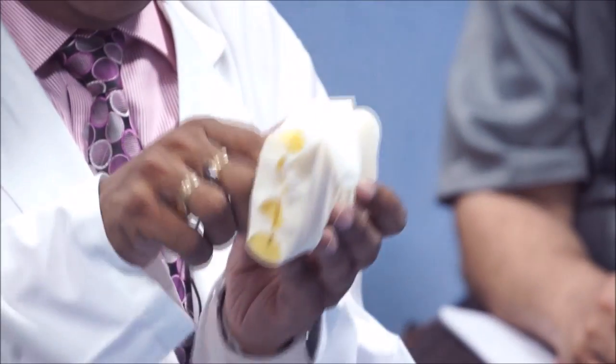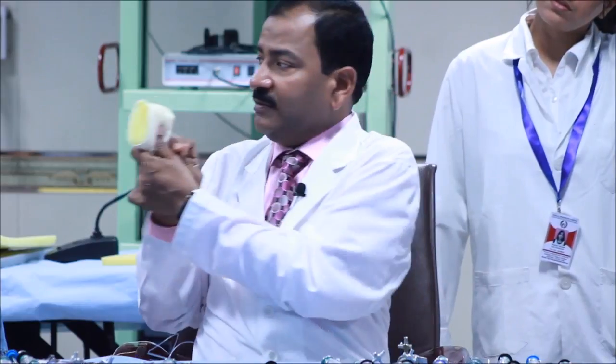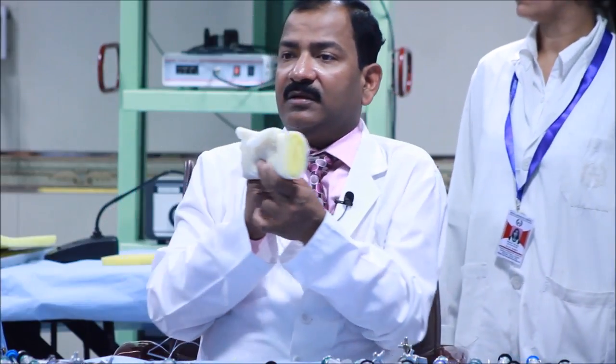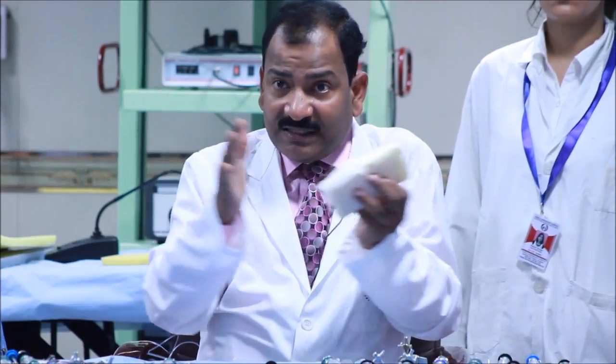And then you tie both. And it is tightened. Port is closed. It's for port site bleeding. This is to tighten the opening. Close the rectus and muscle and every layer together. At the end of the surgery, yes. You mean port closure? Port closure.